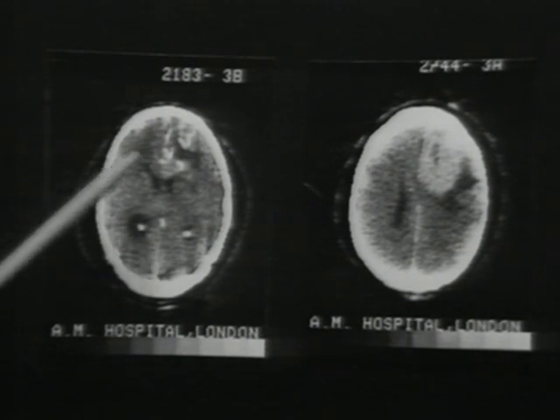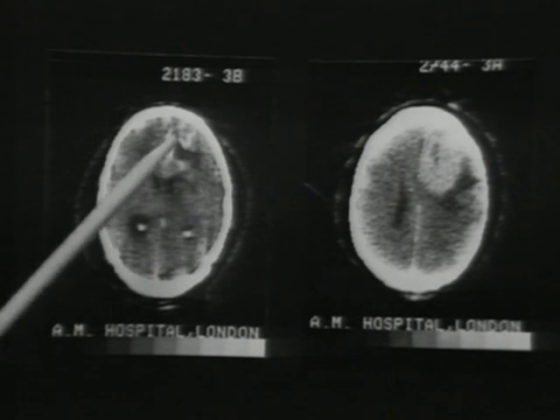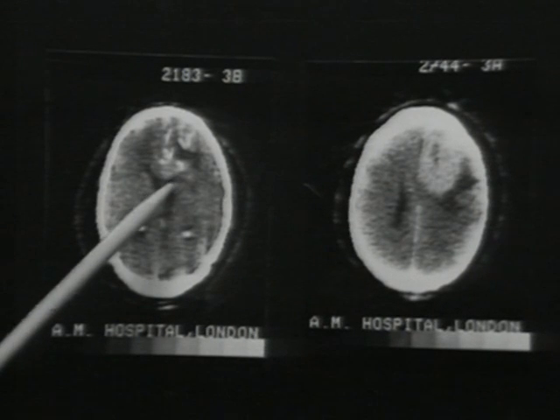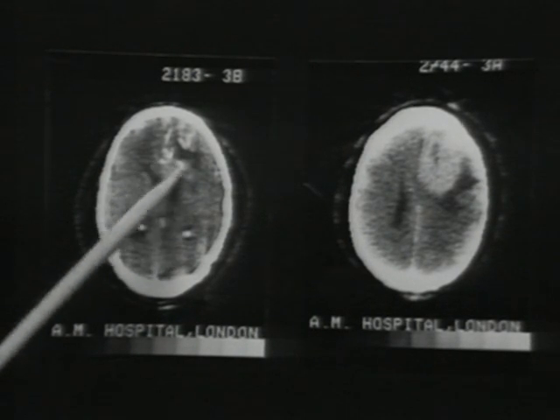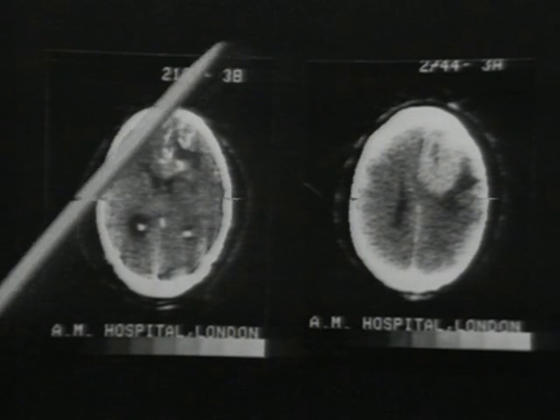Now, this is a patient with an oligodendroglioma, and you can see the calcium aggregates as dense spots within the tumor. It has produced a deformity of the anterior horns of the lateral ventricles and must be clearly extending into the genu of the corpus callosum. The dark area is an area of edema.